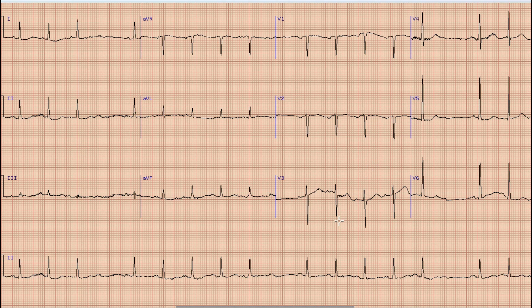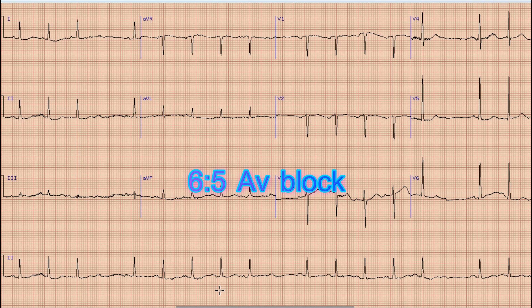Now we look at the P-to-QRS ratio. We can see there are one, two, three, four, five, six P waves for one, two, three, four, five QRS complexes. So this is a 6:5 Mobitz II AV block.